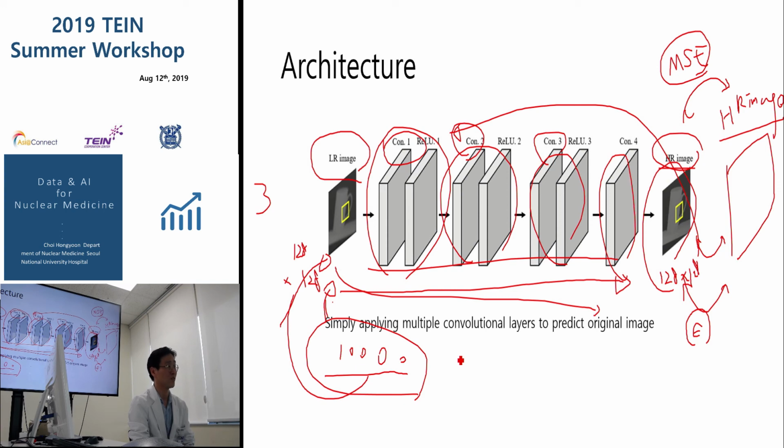I have a question also. We will decrease the dose of the FDG activity, or also the dose of CT used? Will we decrease the dose of both, or only the FDG activity injected? Yeah, many things are possible. Recovery of low dose CT is already possible.